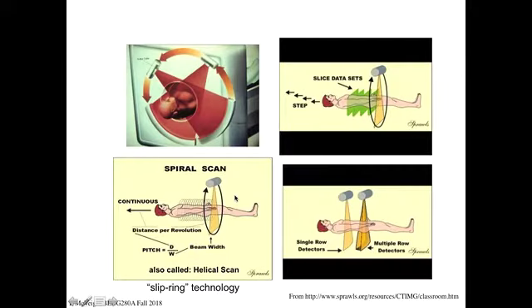So how do you acquire the volume data? This, up in the top left here, is the basic geometry of the CT system, in that we have our source here and our detector over here, and that whole object is going to spin. It's going to spin around the patient, and as it's spinning, for each angle, we'll take data. And so we'll do usually about 800 angles, something like that. Right? And we'll figure out why you want 800 angles.